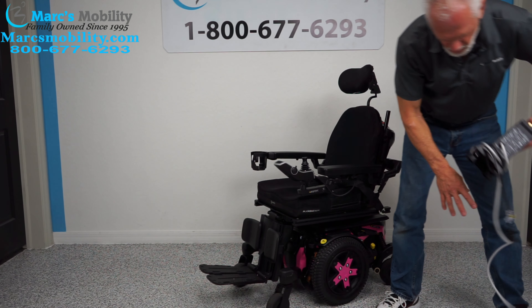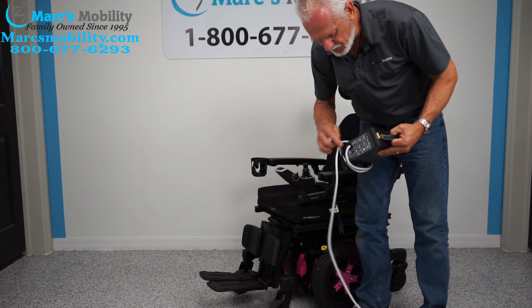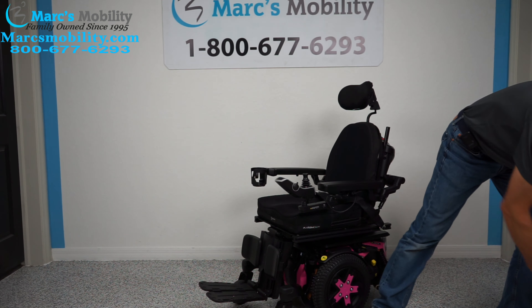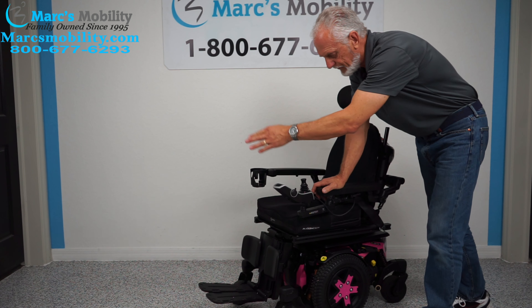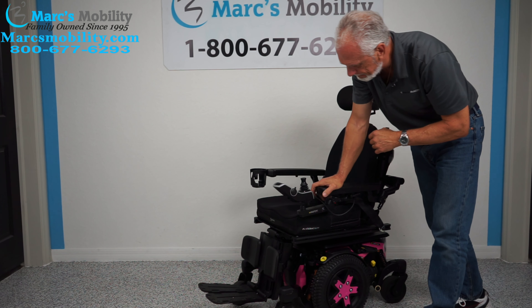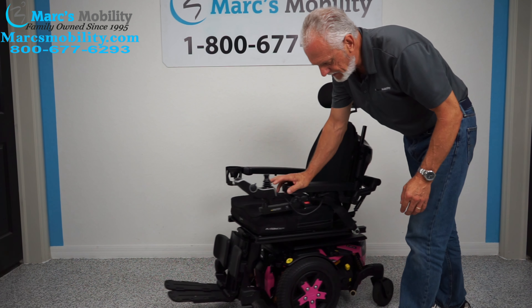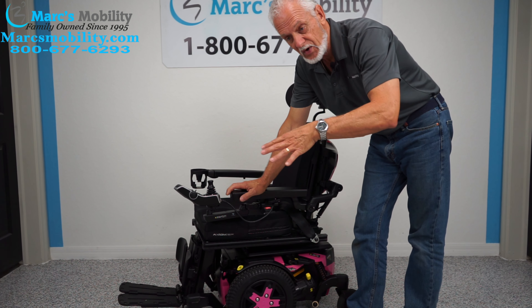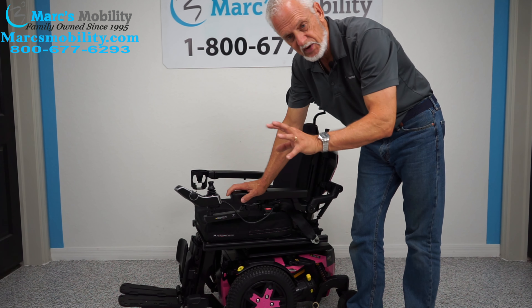When you charge the chair, you take your Quantum charger and plug it right below the joystick. As soon as the light goes from orange to green, the charger will stop charging. There are two 55-amp batteries in this chair, and they'll give you about 15 miles on a charge — though that depends on whether you're going uphill and how many functions you use during the day.